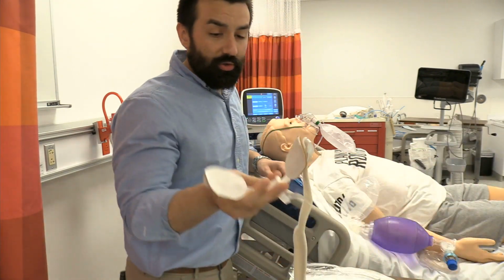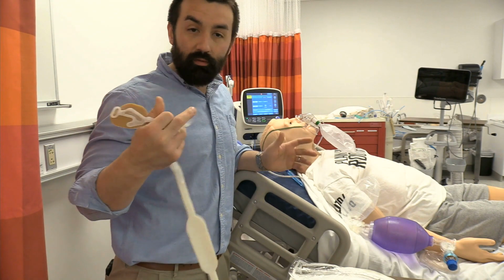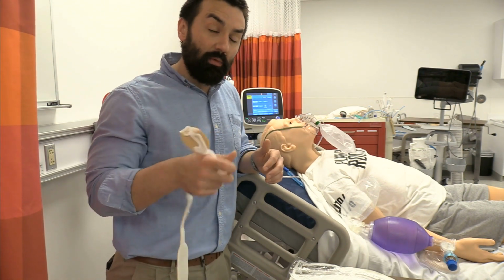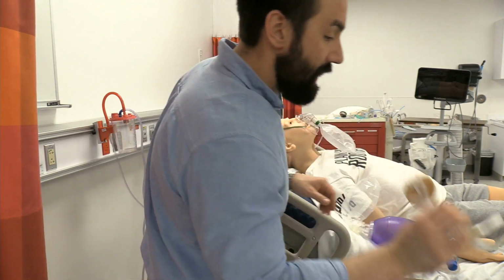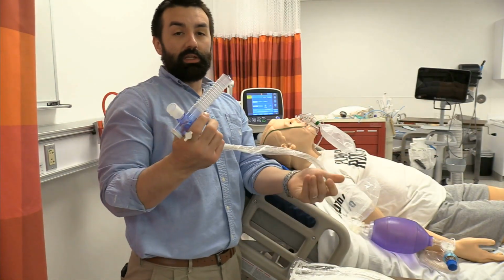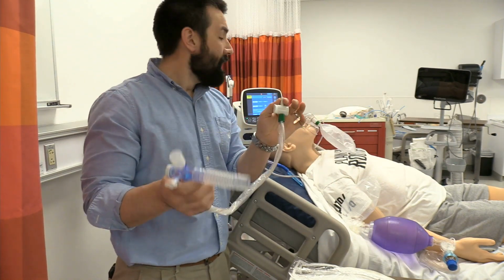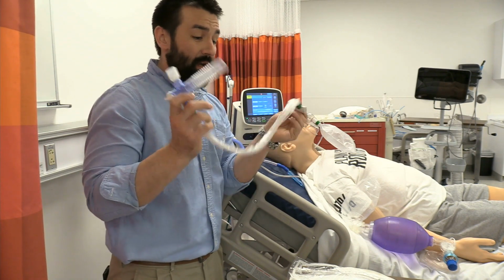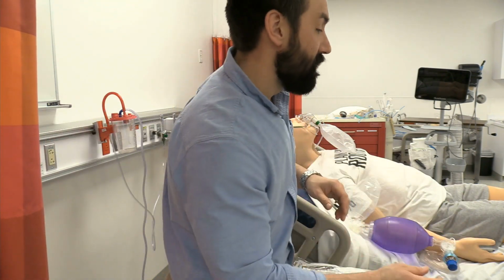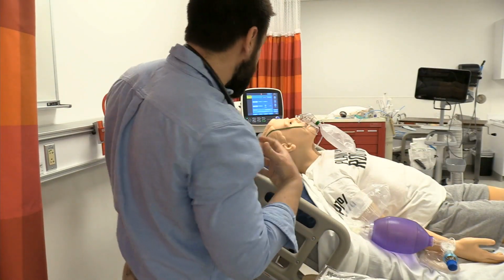I have a commercial tube securing device, or Anchor Fast here, so that's just going to be once we've quickly confirmed placement, we're in the right spot, we're going to keep that airway stabilized until I can permanently secure that. And then also, not 100% required here, but we are going to use this once they're on the ventilator, an appropriate size inline suction catheter. If a bunch of stuff starts coming out of this tube, it's going to be very important that we can suck them out while we're able to provide manual resuscitation. Helps us not get sprayed. I got a stethoscope here as well.